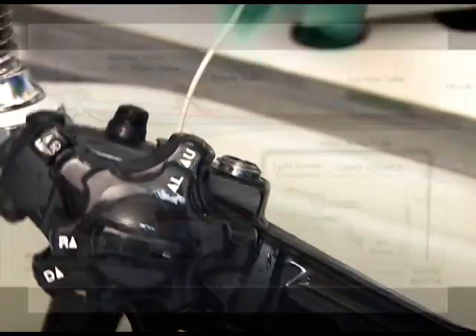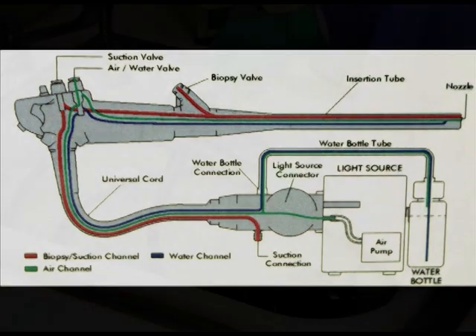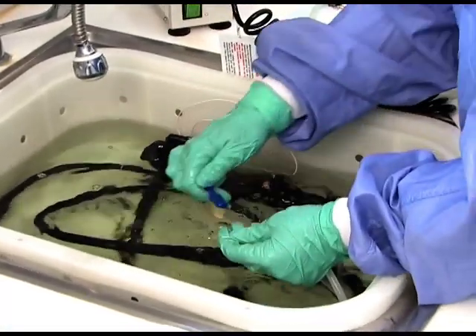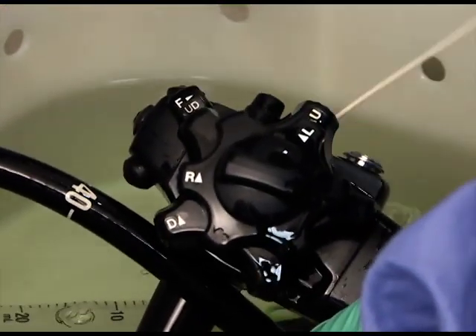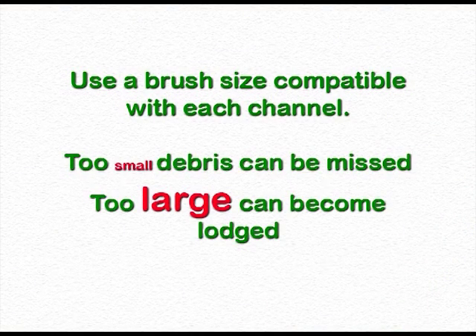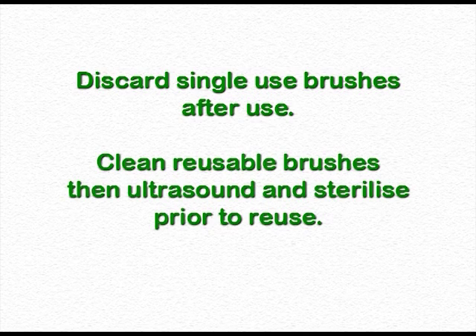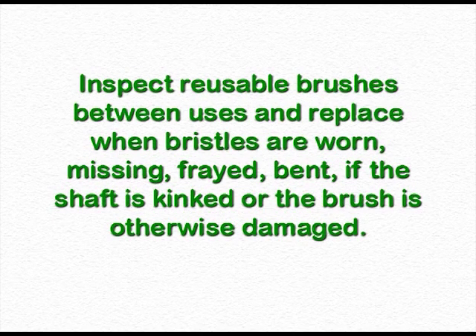Using a long brush, brush all accessible endoscope channels including the body, the insertion tube, and the umbilical cable or universal cord. After each brush passage, the tip should be checked for debris before retracting or reinsertion. Rinse the brush tip in the detergent solution, removing any visible debris, and continue brushing until there is no debris visible on the brush tip. Use a brush size compatible with each channel — if the brush is too small, debris can be missed; too large a brush can become lodged. Discard single-use brushes after use. Clean reusable brushes, then ultrasound and sterilise prior to reuse. Inspect reusable brushes between uses and replace when bristles are worn, missing, frayed, or bent, or if the shaft is kinked or the brush is otherwise damaged.